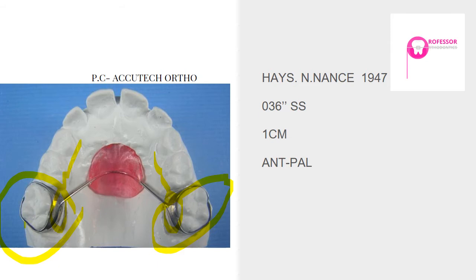To double ligate the banded Nance button: first use a greater diameter stainless steel ligature wire and tie it in the mesiodistal of the appliance. After the stainless steel ligature is engaged and the ligature wire completely secured at the mesial and distal ends, additionally secure the appliance in the molar bracket slot with an O-ring. This way you have both the ligature wire and the O-ring holding the appliance in place.